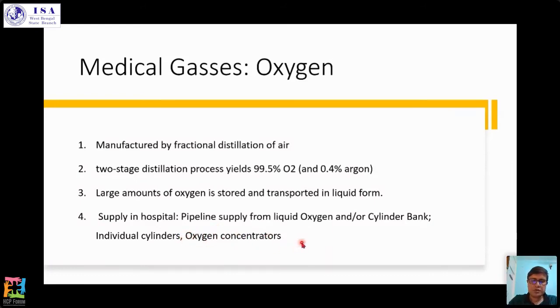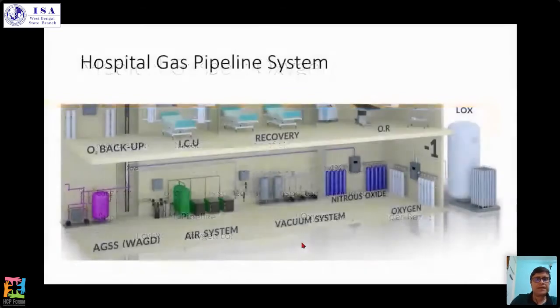Oxygen concentrators are another thing. We are not going to discuss these things, but they use zeolite to filter nitrogen, carbon dioxide and water vapor, and can get a really high concentration of oxygen, say 90%, 95%.